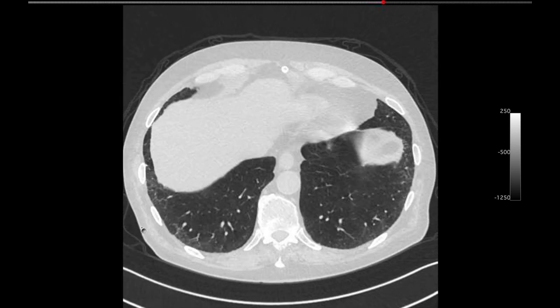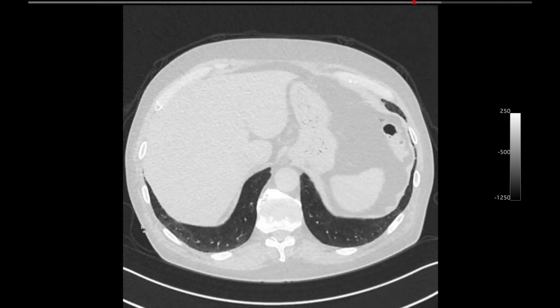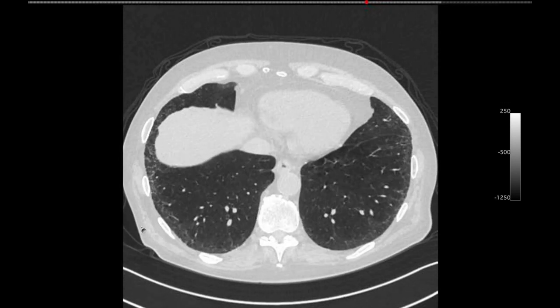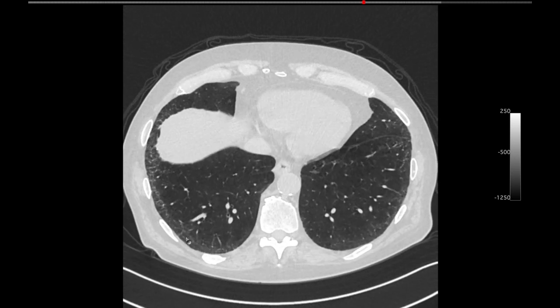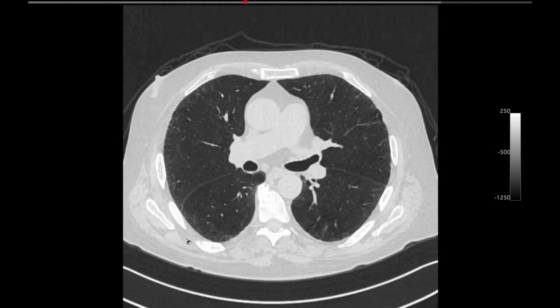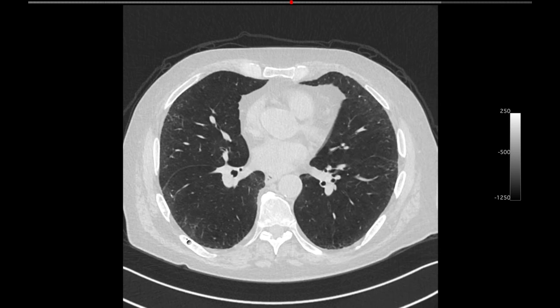I don't think I saw anywhere any subpleural traction bronchiolectasis. There are no subpleural cystic spaces. There are no foci away from the pleural surface of traction bronchiectasis, but just reticulation and small areas, of course, of ground glass opacity only. So I suppose if a question came up, depending on the context of, say, UIP, I think that one would reasonably say this is indeterminate for that.